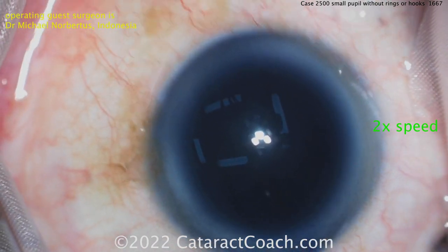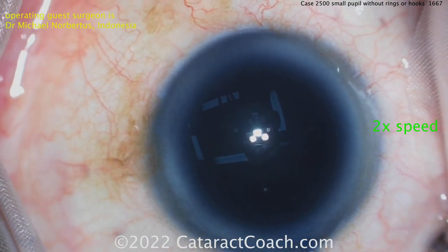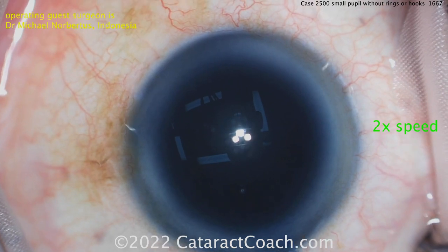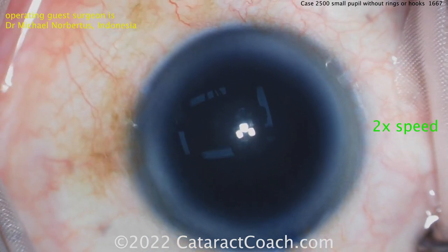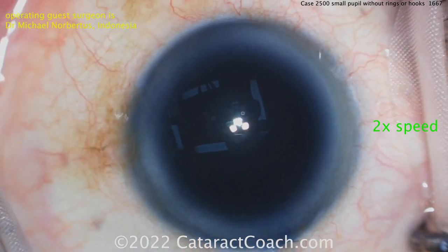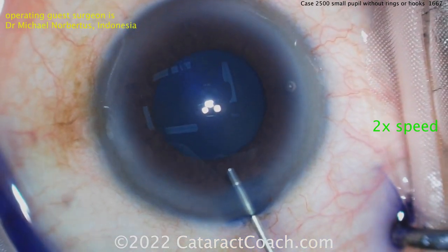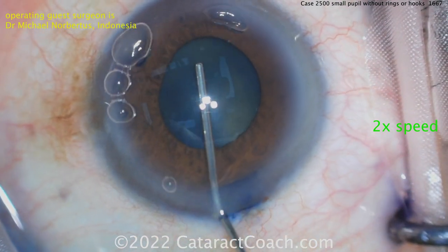Putting in the trypan blue dye, letting it wait a little bit so it really gets a good stain of the lens capsule, and then it can be washed out and the cataract surgery can proceed. Now washing out the blue dye - look what a beautiful stain. It also stains the stroma of the incision, so you can see that's a beautiful incision.